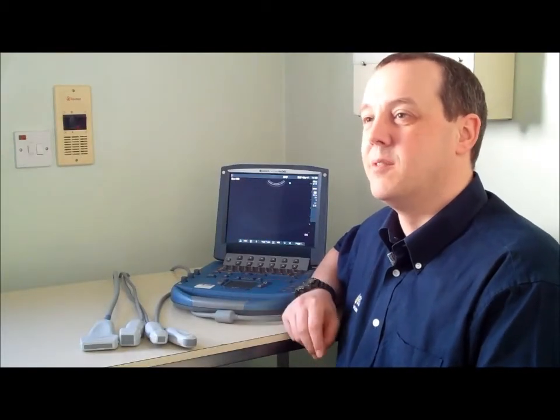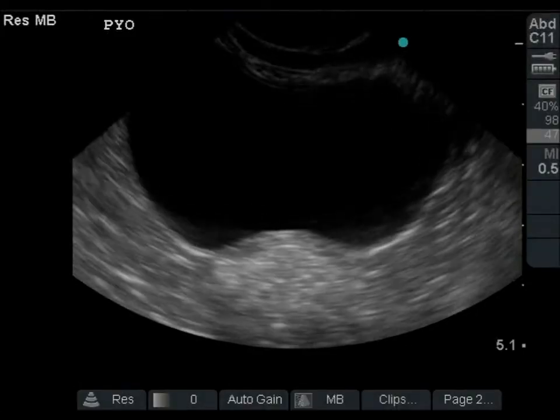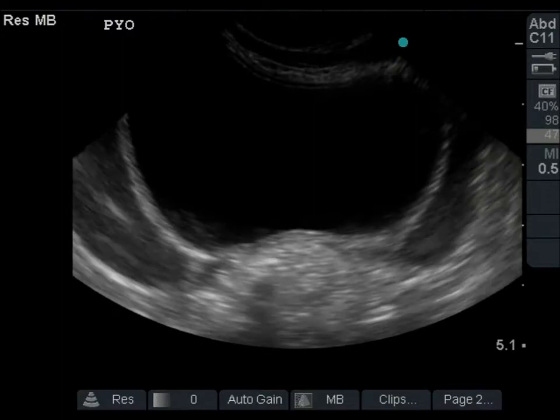The 15-second boot-up time means you'll soon be scanning and in front of the patient. Patient entry is incredibly simple and the system comes with some fantastic presets, which means once you put the probe on you straight away get a good image. Because it's really portable and good quality, we can save all the pictures.